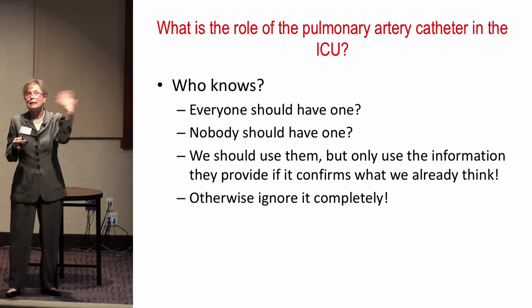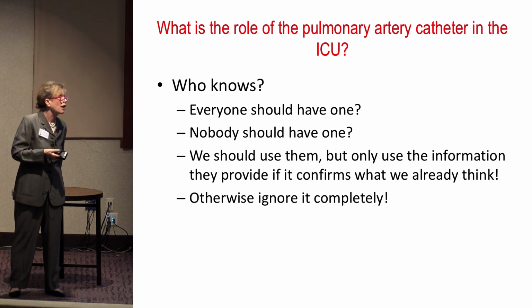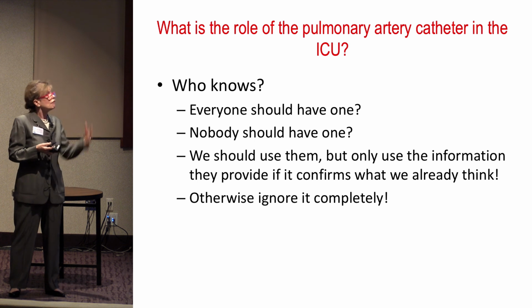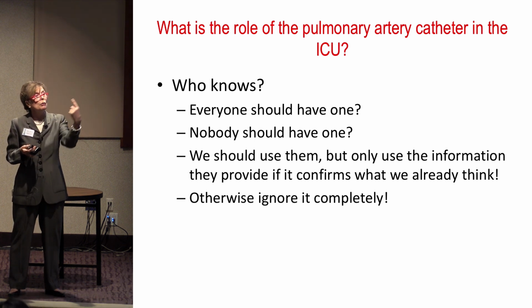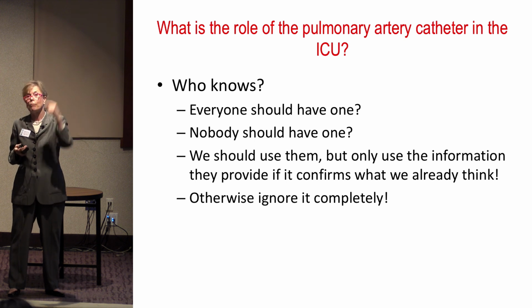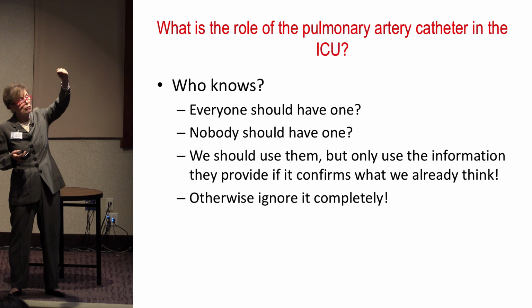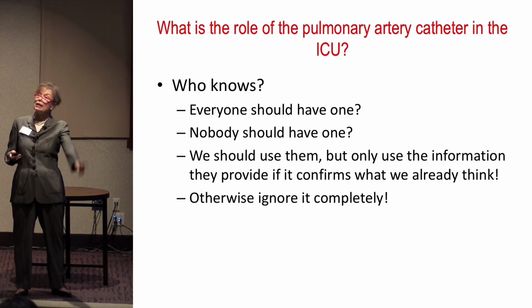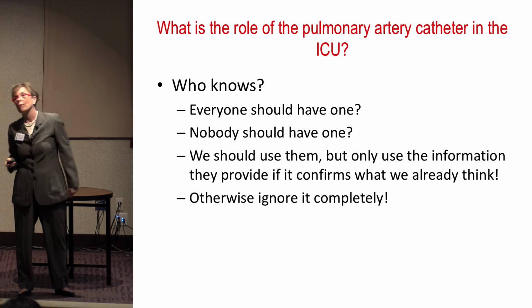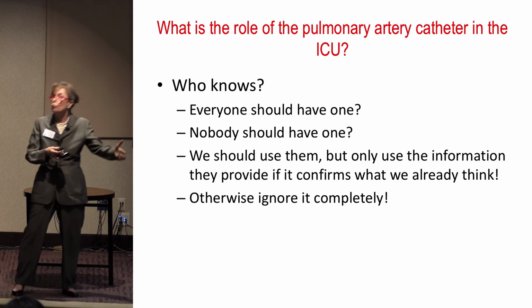And what we as bedside nurses see is that PA catheters get placed, but no one pays any attention to the data. But if I'm looking at a person who is in ARDS, who is requiring 5, 10, 15 of PEEP or airway pressure release ventilation, and I have a PA catheter and I see those PA pressures go up, and I see the end-tidal CO2 go down, and I see the venous CO2 go up, that's a perfusion problem. That's not a ventilation problem. I'm not going to address it with the ventilator. I want to address it with perfusion.